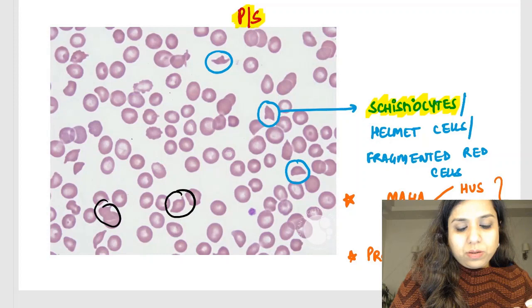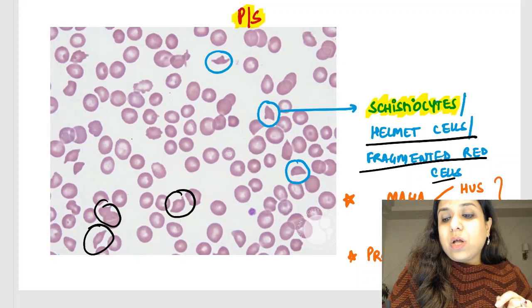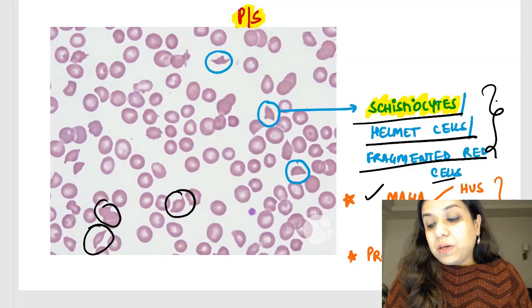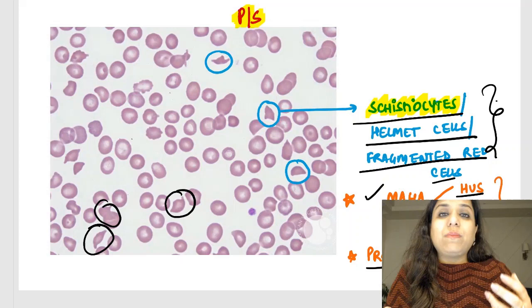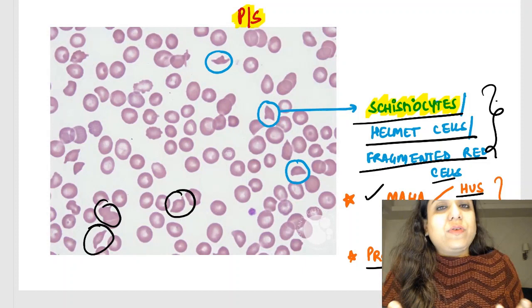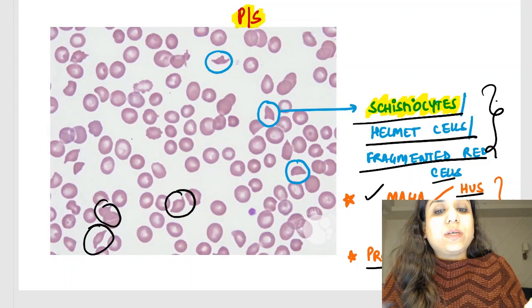What are these cells? Don't you think they look like a helmet — somebody has worn a helmet? That is why they are called helmet cells, also called fragmented red cells or schistocytes. Schistocytes, also called helmet cells and fragmented red cells, are seen in microangiopathic hemolytic anemias like HUS, TTP, DIC, and prosthetic cardiac valves. Sometimes there can be a history of a patient with a damaged aortic valve replaced by an artificial valve — all cases of prosthetic cardiac valves or microangiopathic hemolytic anemias will show this finding.